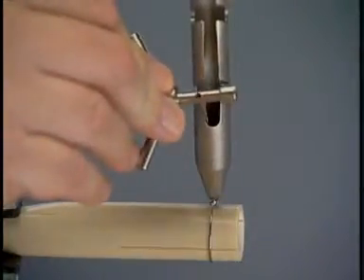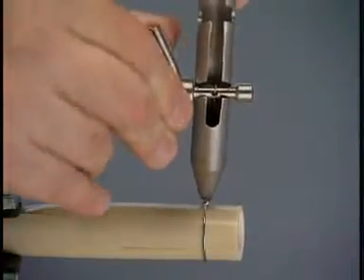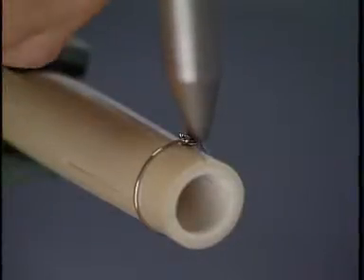The straight end of the wire is passed through the opening in the wire tightener. The wire is then passed through the hole in the center of the peg and the peg turned to tighten the wire. Once the wire is secured around the bone, it must be bent away from the eye to lock it in place.